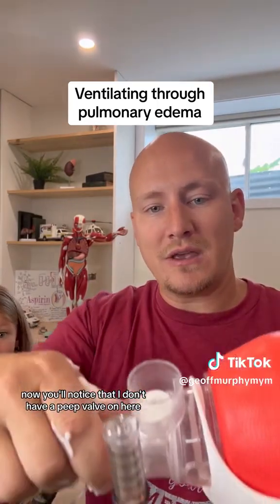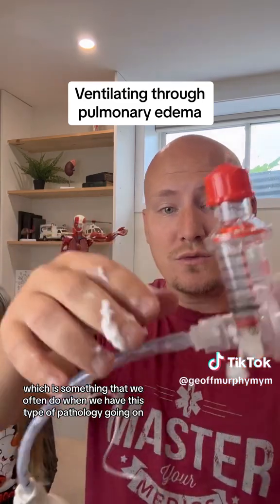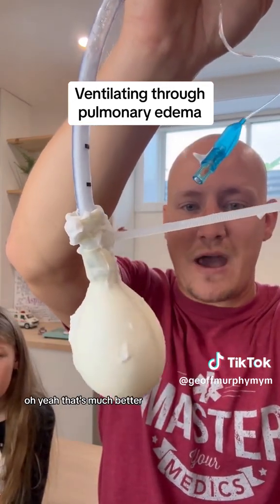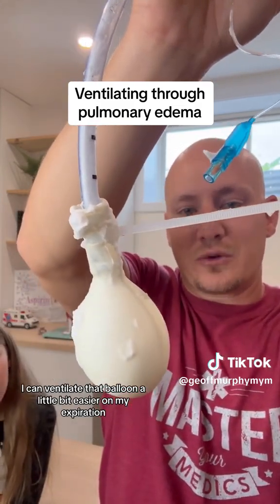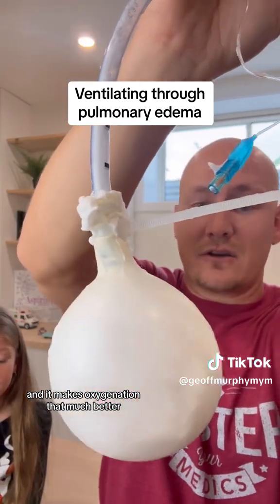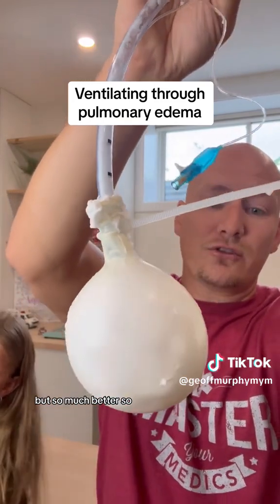You'll notice that I don't have a PEEP valve on here. Let's use that PEEP valve, which is something we often do when we have this type of pathology, and see how much better I can ventilate. Oh yeah, that's much better. As you can see, I can ventilate that balloon a little bit easier. On expiration, I'm not losing as much of that recruitment, and it makes oxygenation that much better.